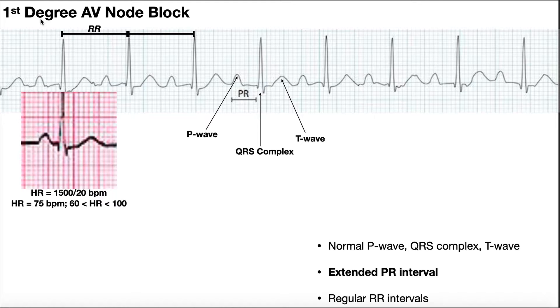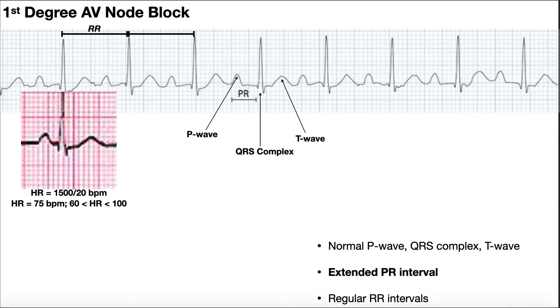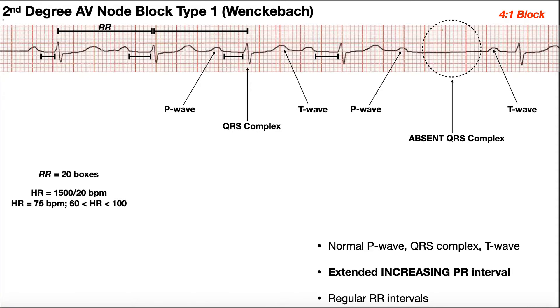With a first degree AV node block, you have that extended PR interval, but notice there are no QRS complexes that are absent — they're all there. The first degree AV node block looks like everything is normal and can often be mistaken for normal sinus rhythm, but the PR interval is extended. No QRS complexes are dropped — that's not the case in the second degree AV node block.